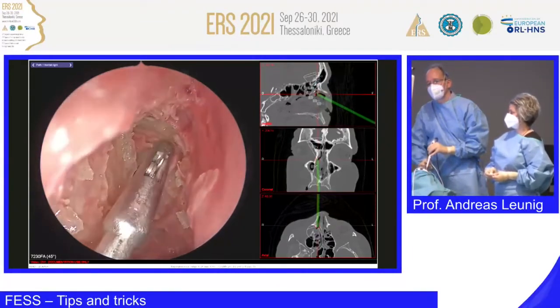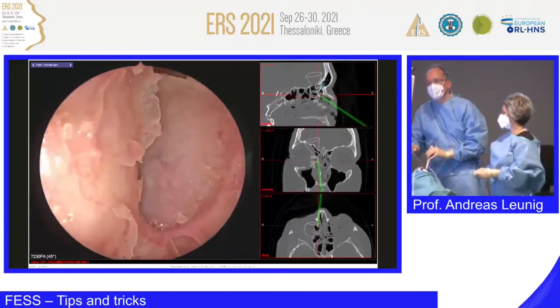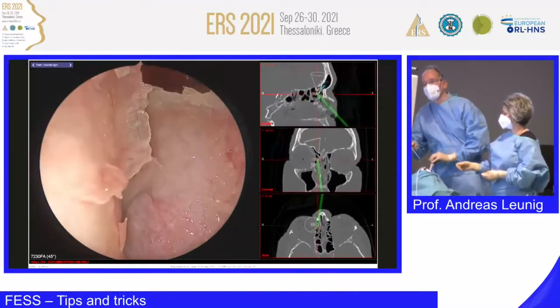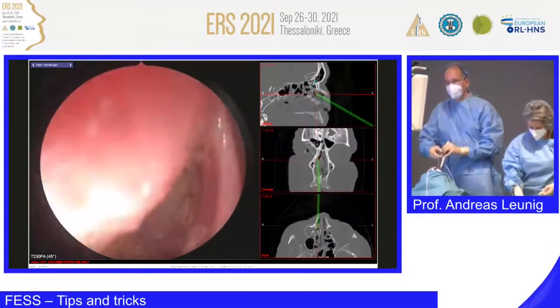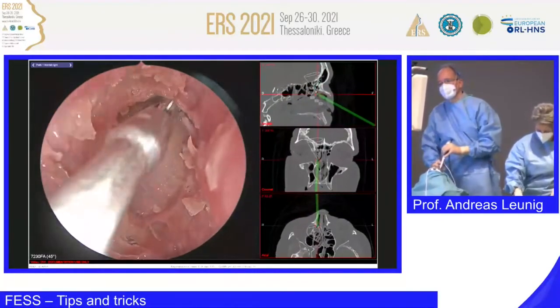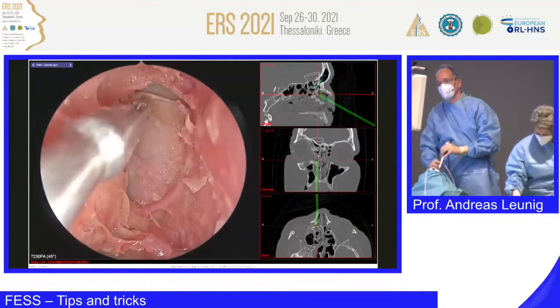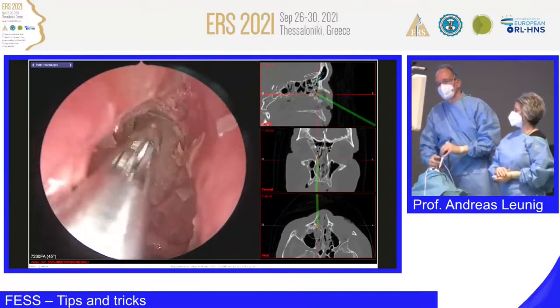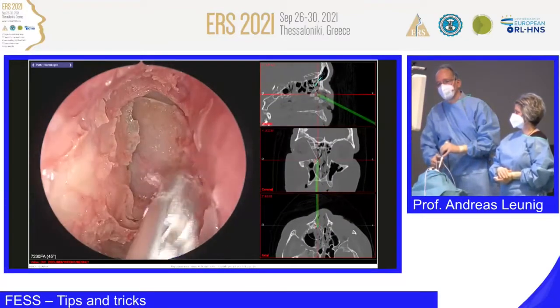Usually you leave the mucosa there. I tear it out just to show you how it looks when you go up there. That's the bony lamellas, which were blocking the outflow tract in this case. And you can go there and make a little bit more precise dissection.